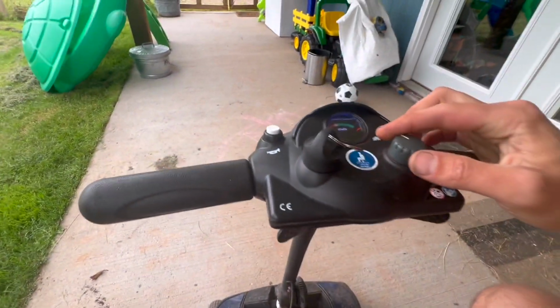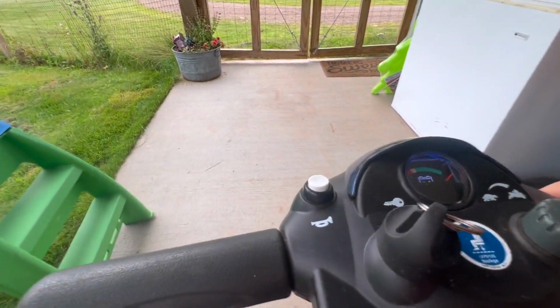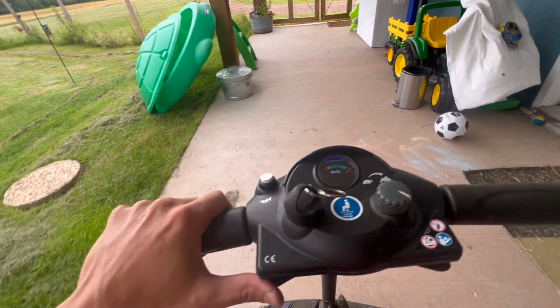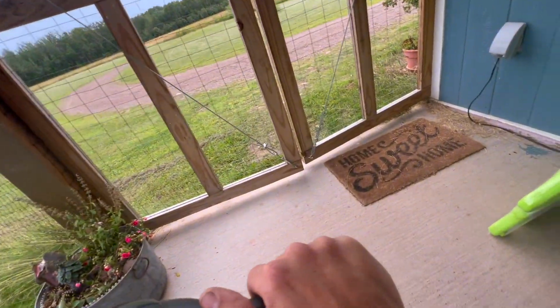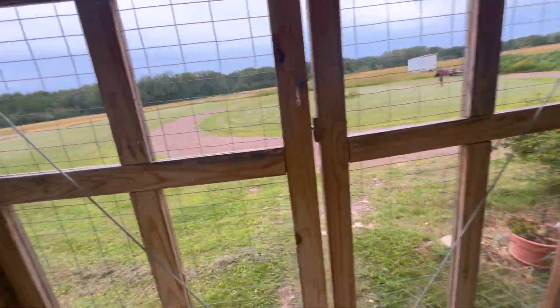We have voltage. We have our little beeper. Let's take this thing for a cruise. I don't have much of anywhere to test it. Oh yeah. We're flying. Let's see, can we back up? Oh yeah. Whoa. This thing's kind of fun. I don't think it's going to work too well on the gravel. You know, we don't have off-roading tires. Maybe. Let's see what we can do.